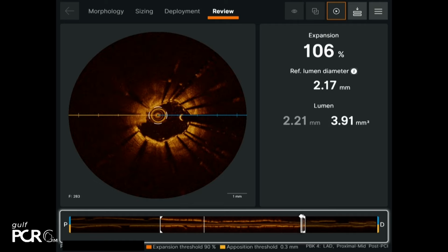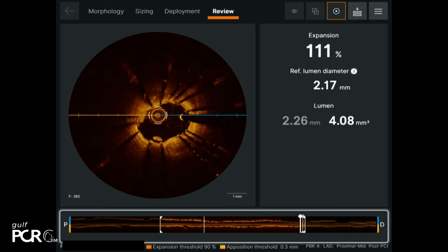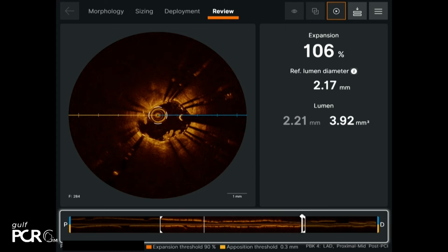Yeah, this is the stent here. So that arc of calcium at 8 o'clock is causing the stent to underexpand a little bit here. And distal to the stent, there's a little landing zone 5 to 8 millimeters away from the stent. In this area specifically, you can see a large chunk of calcium from 5 o'clock all the way to 2 o'clock, and this is causing the stent to be underexpanded significantly. I don't trust this computer analysis 106%. That's my impression. You see some thrombus forming there, and distal to that, you actually have a landing zone. Probably there's something we can do here for that.